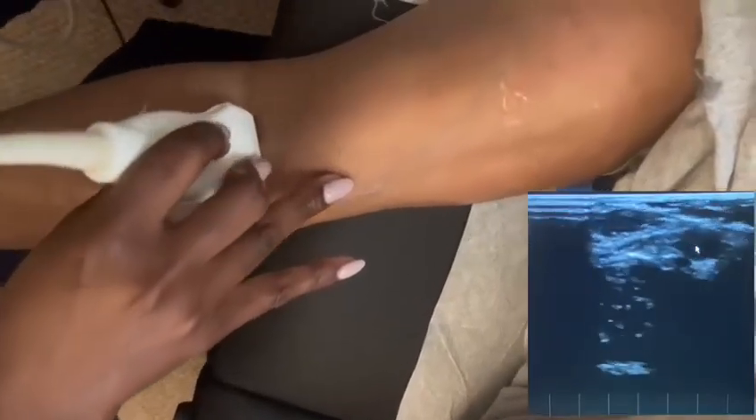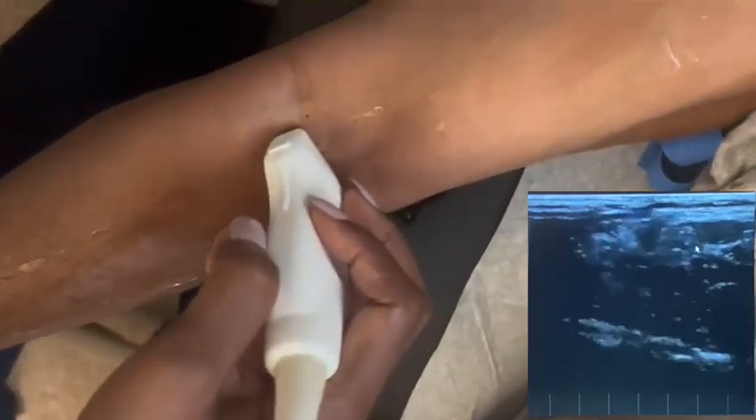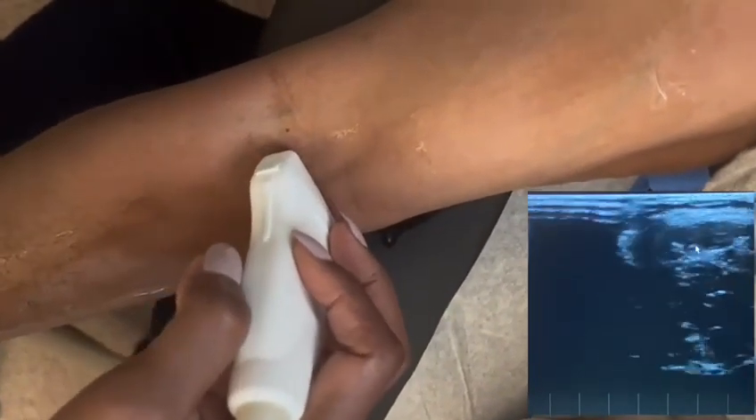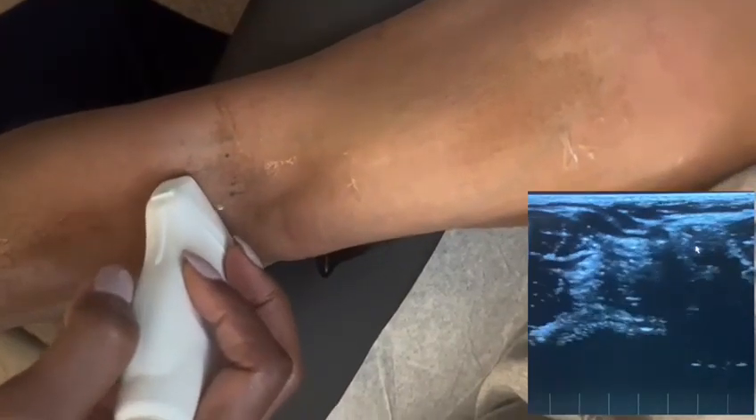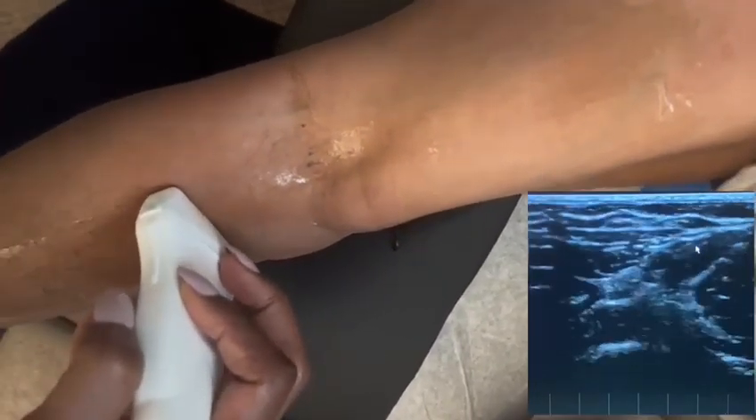I like to take a look at the fossa. At this point, you can have the patient bring their arm right back over and look at the fossa again. You can see the veins and the artery. Keep an eye on that — at some point you would see the split, and you can see that split taking place there.